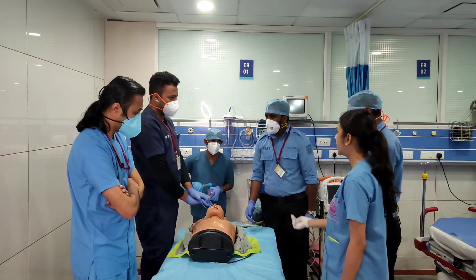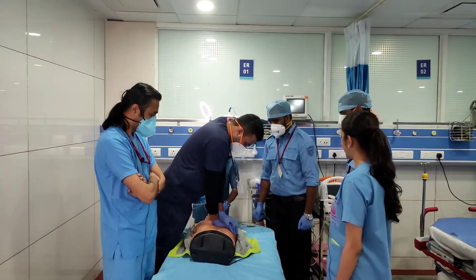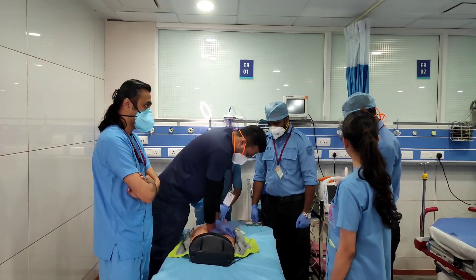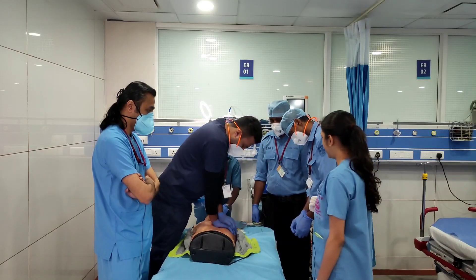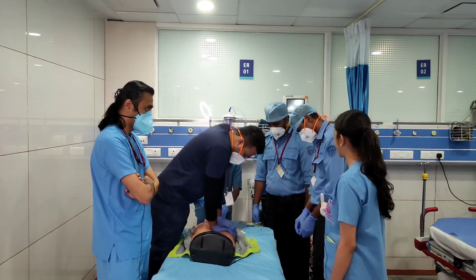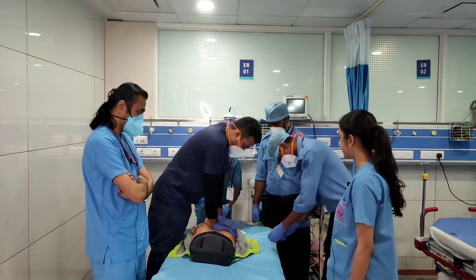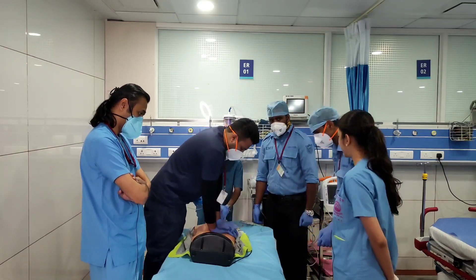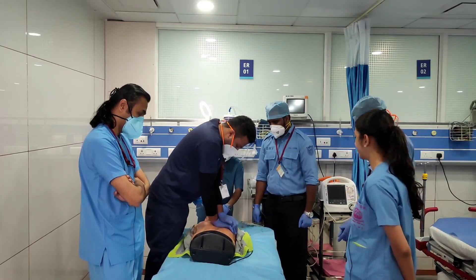Asystole. The rhythm is asystole. Continue the CPR. Is the first dose of adrenaline loaded? Load and administer adrenaline to the patient, followed by a 10 ml NS flush.